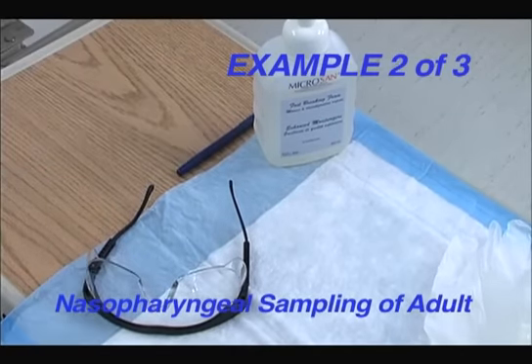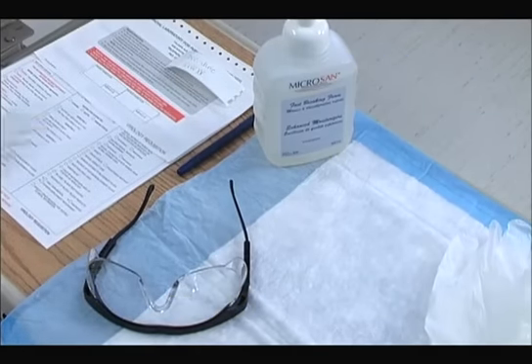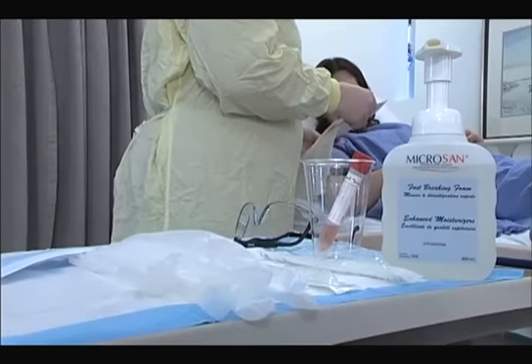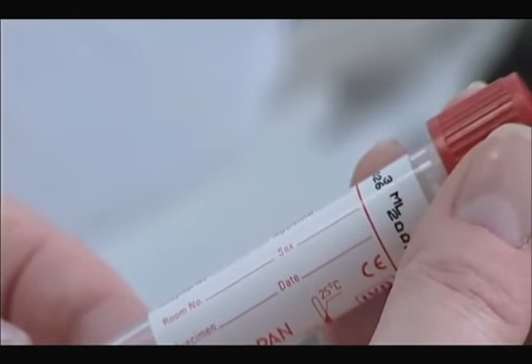Prior to collecting a nasopharyngeal swab, assemble the appropriate supplies such as a pen, requisition, and viral transport medium. And can we just double check the requisition against your name? Check that you have the correct patient. Check the expiry date of the transport medium to ensure that it has not expired.